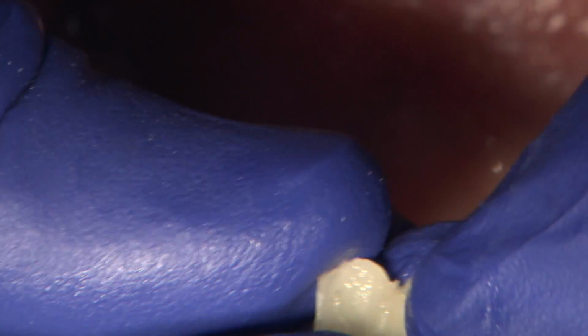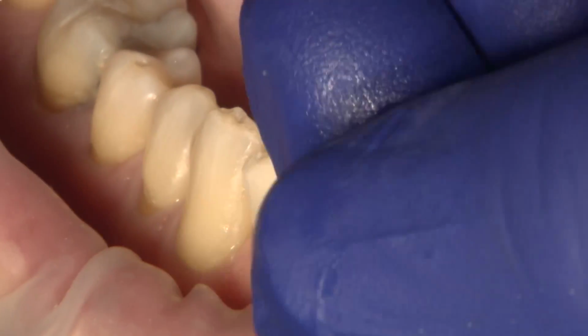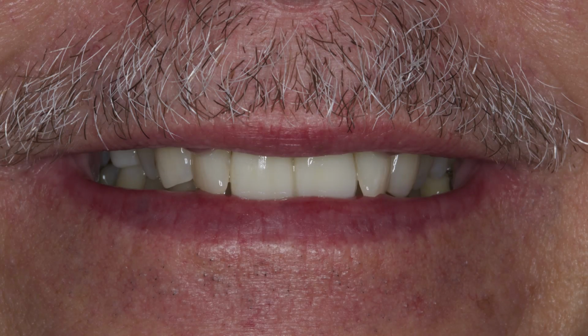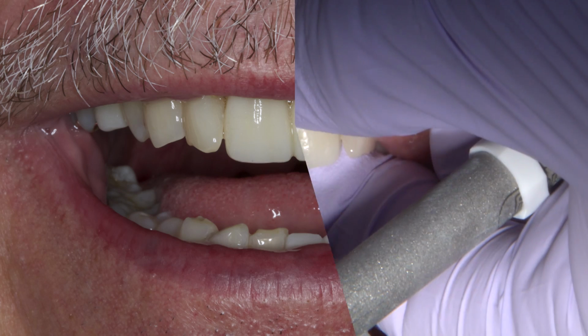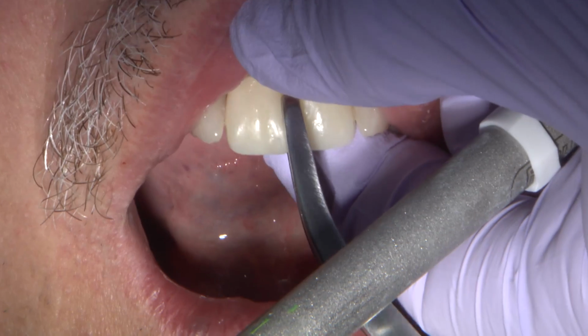The same relining procedure is done on the splinted Biotemp veneers for 23 and 24, and also the same on number 4. As you can see, for these aesthetic cases, Biotemp is certainly a great option as it gives you a really nice surface smoothness and luster, and all you really need to do is custom fit it by relining it onto your preparations.